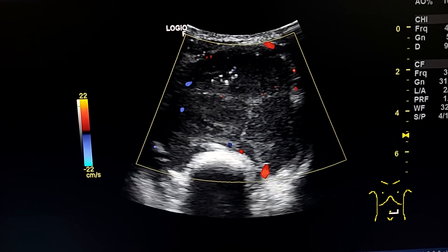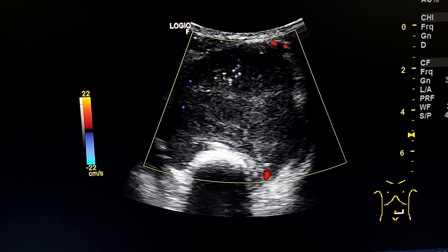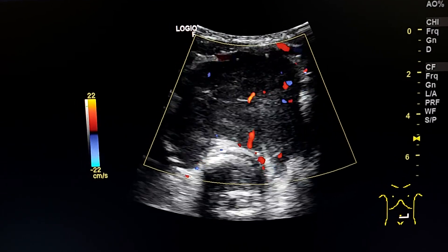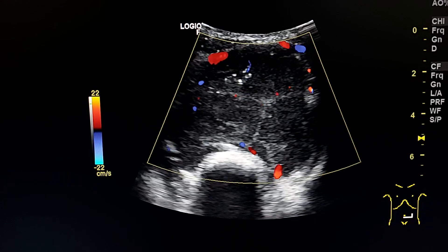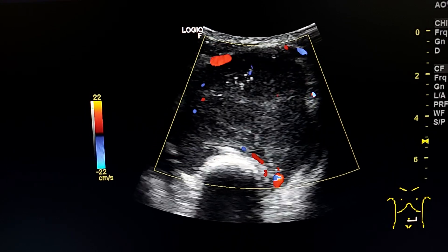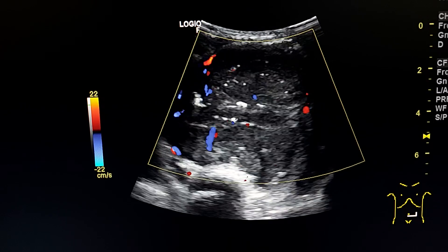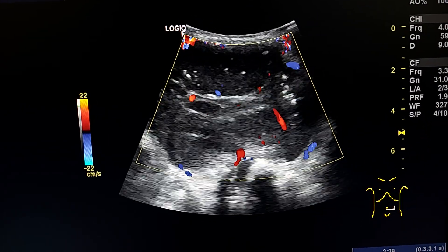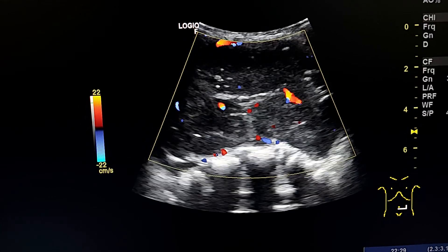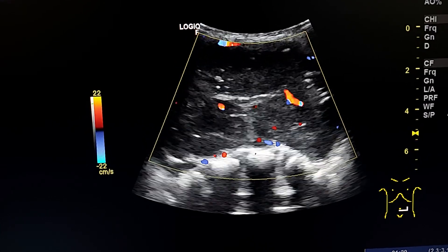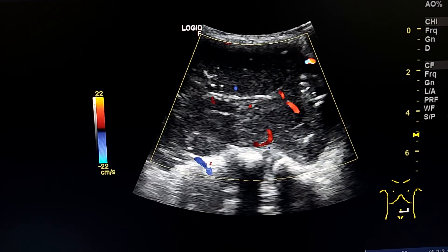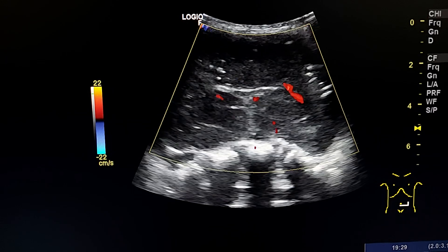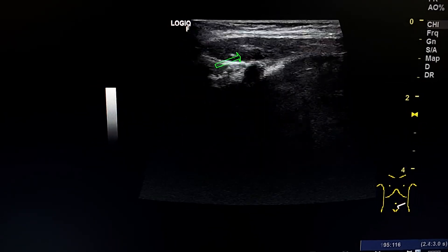By color Doppler, we see diffuse vascularity in the mass. The mass was confirmed to be a ganglioneuroma by biopsy.